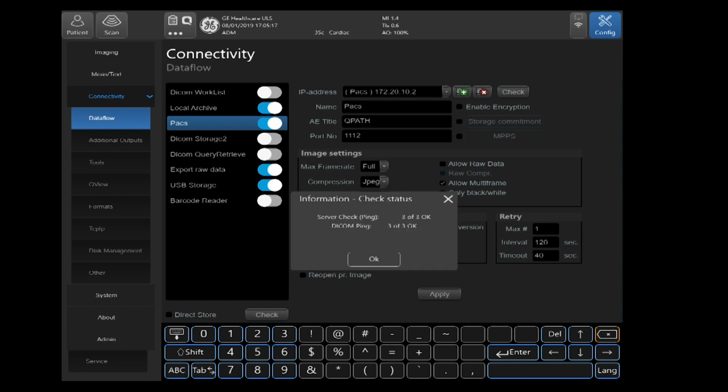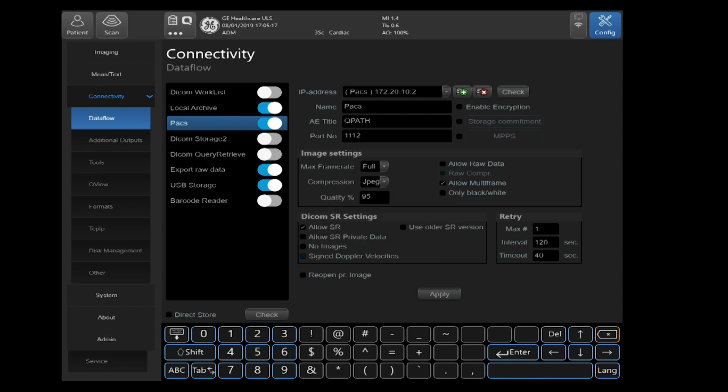And you will get an information check status window. You'll get a server check, 3 of 3 okay. This indicates you have good communications between the ultrasound machine and the computer you're sending to. And you'll get a DICOM ping, 3 of 3 okay. This indicates you've got good communications from the DICOM software on the ultrasound machine to the DICOM PACS software running on that server or that computer. Select okay. And you are now completed with your PACS configuration.